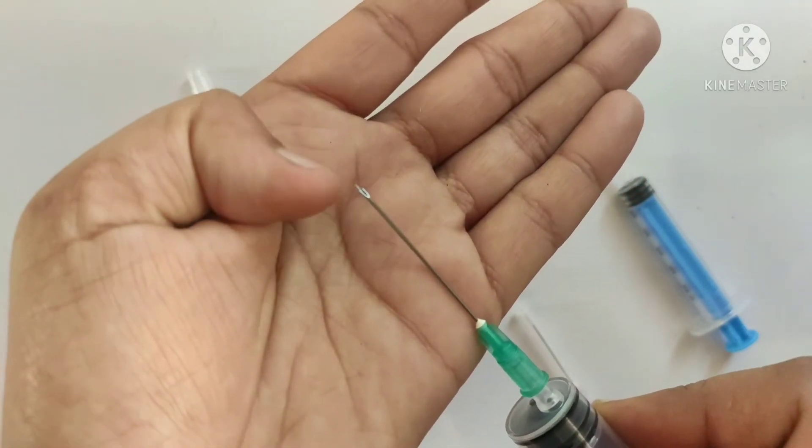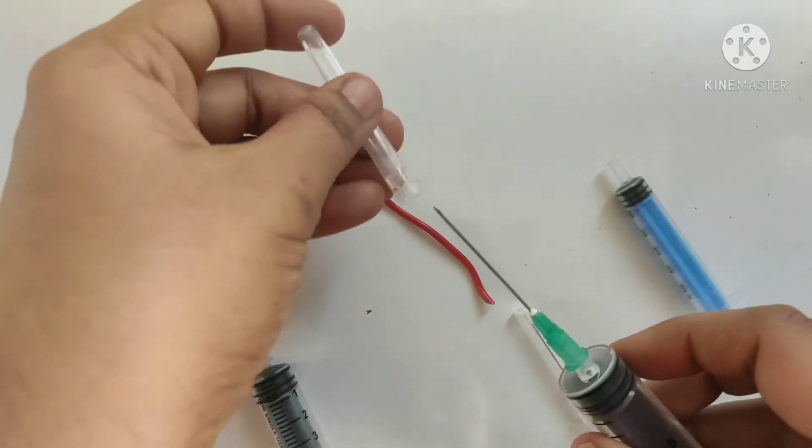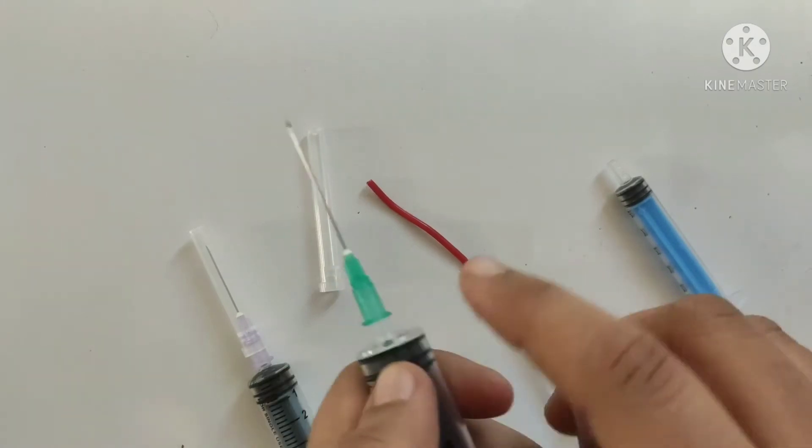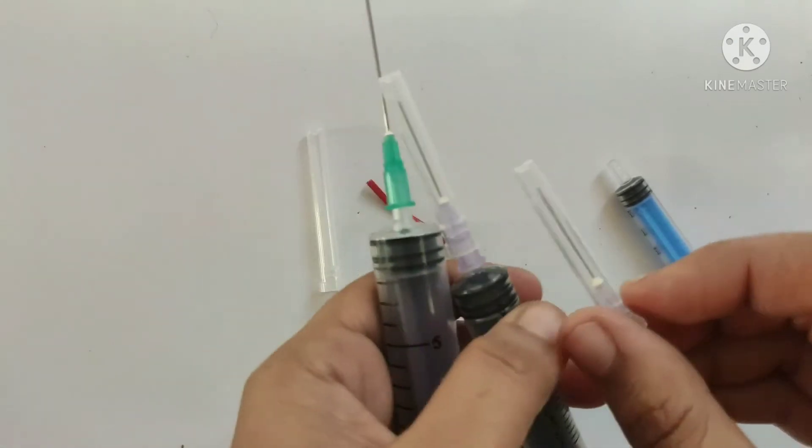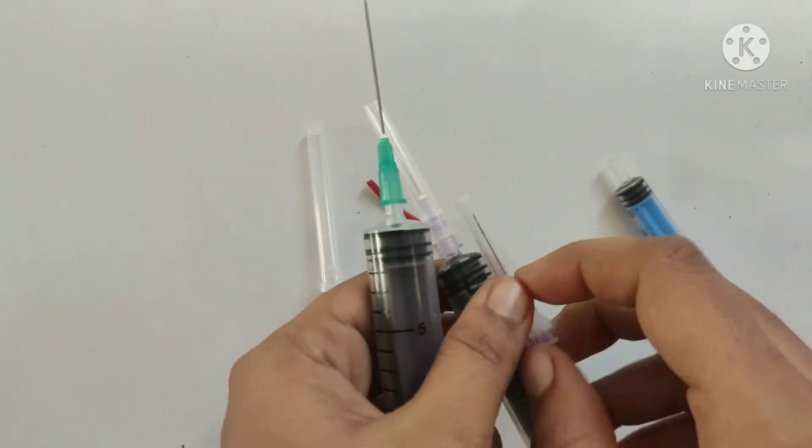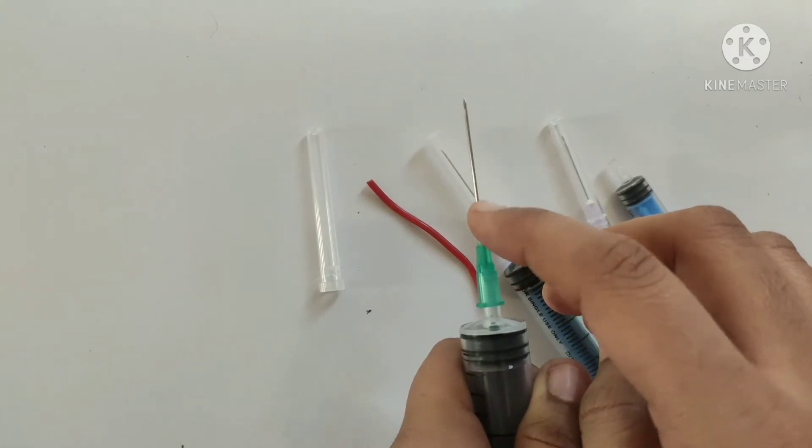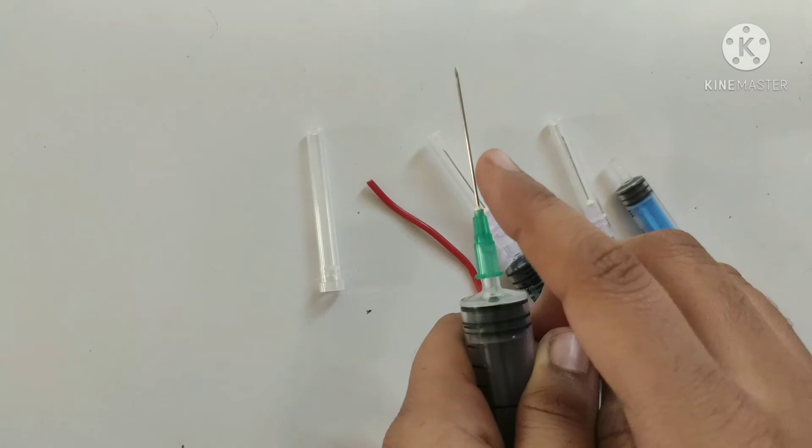This is known as beveled tip. Now the hub of different needles is of different color. See, it is green color, this one is purple color, and this is also purple color. The color of the hub indicates the inner diameter of the shaft when it is measured in gauge or millimeter. Higher the number of gauge, smaller will be the diameter.